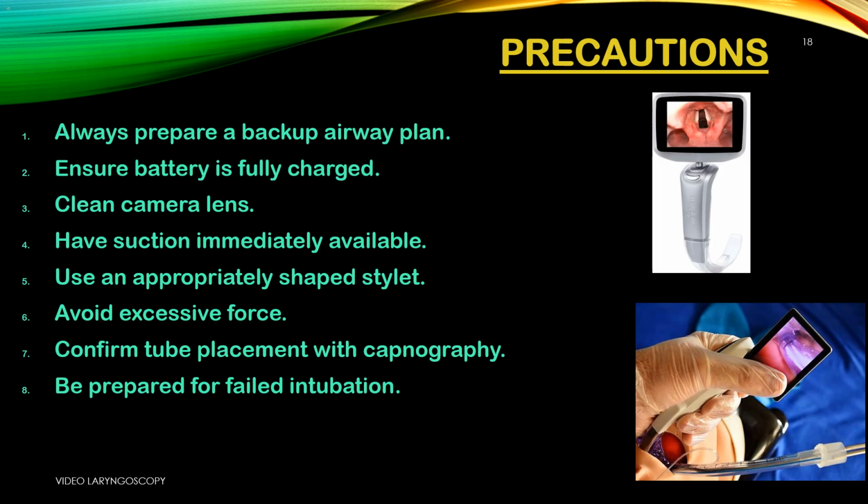6. Avoid excessive force. Gentle technique prevents dental, lip, and airway trauma. Let the camera do the work. 7. Confirm tube placement with capnography. Waveform CO2 is the gold standard. Proves the tube is in the trachea, not the esophagus.